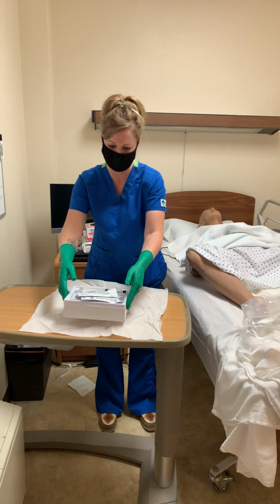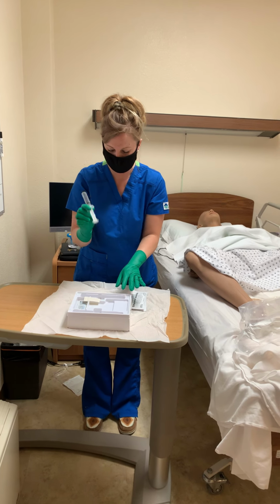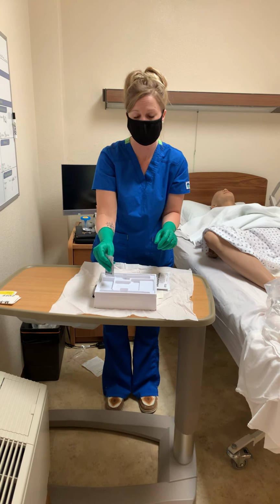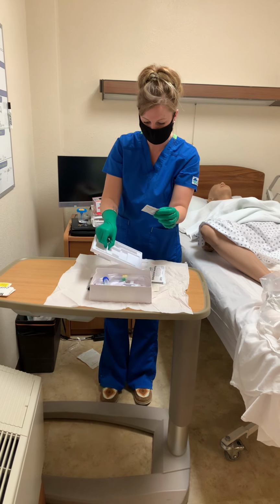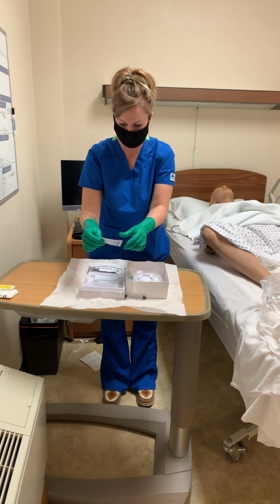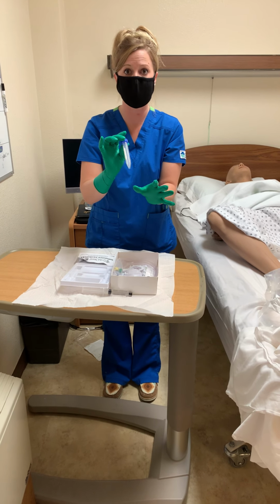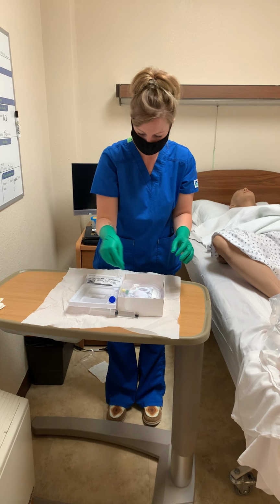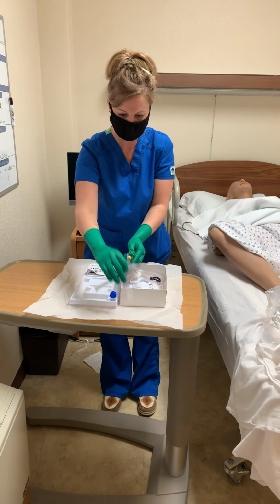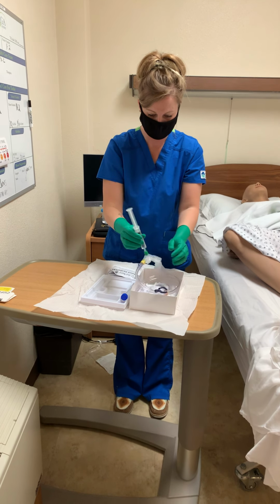Okay, because this is sterile, an inch border, I'm going to separate. I have my swabs for cleaning. I have my 5 milliliters of water. What I would normally do here is take the lube and put it right in the top here, and then that would hold the catheter tip in there. But we're not going to use this, so we're going to set it there. This is for my urine specimen. Put that here. I am going to take my water and put it on here, and set that in here.